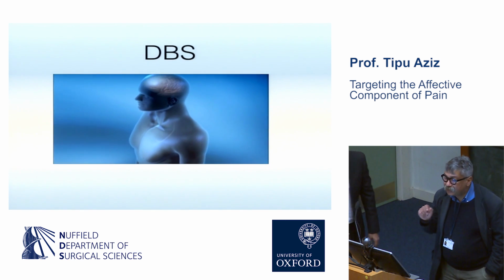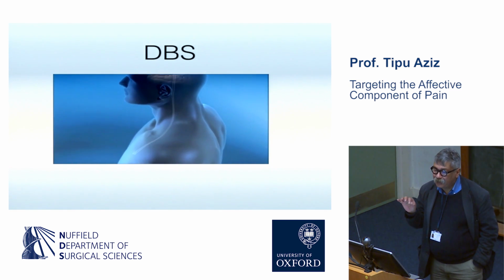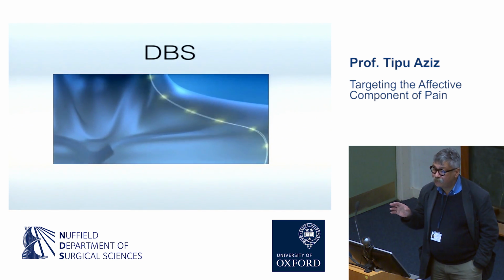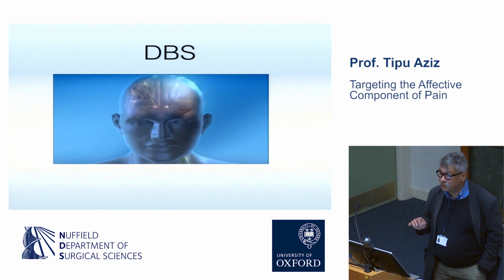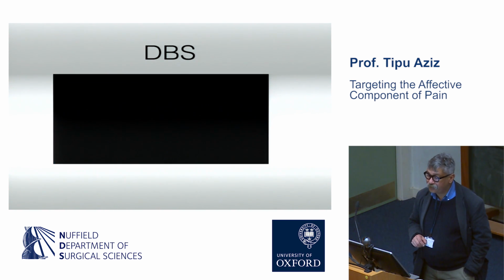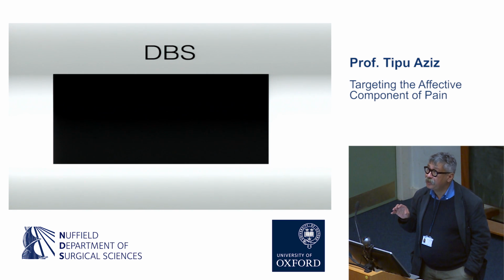Basically, what deep brain stimulation does is we take a patient with any affliction, and if we know the target region, from a pacemaker implanted under the skin, very much like a cardiac pacemaker, we have wires running up to connect to electrodes implanted in the deep brain target and alter its function electronically. We can do that remotely, so the patient never requires repeated surgery for that. But what we do have these days are rechargeable pacemakers, which last upwards of 30 years, which means that patients only have one such implant in their lifetime.